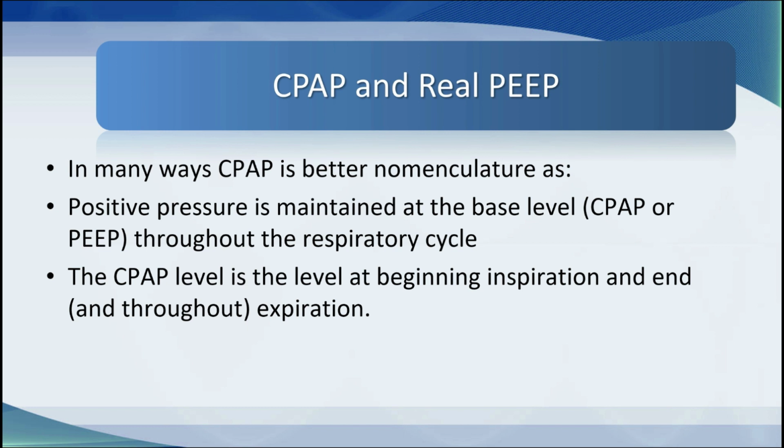However, to be consistent with normal terminology, I will use the term CPAP for describing patients getting positive pressure through a face mask or a nasal face mask or even a tracheostomy using generally a non-invasive ventilator or some other device, and I will use PEEP when I'm referring to positive end expiratory pressure during invasive mechanical ventilation or non-invasive ventilation, where the patient will get additional flow during inspiration.